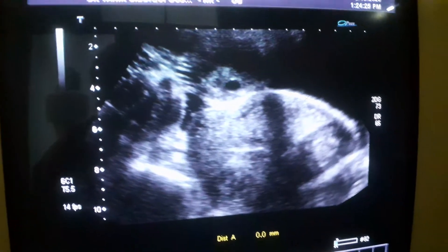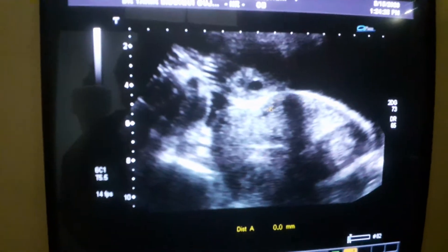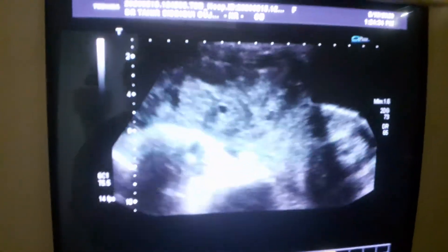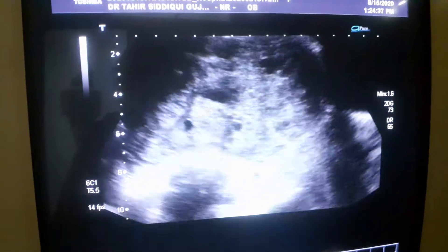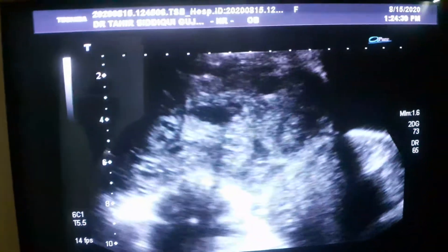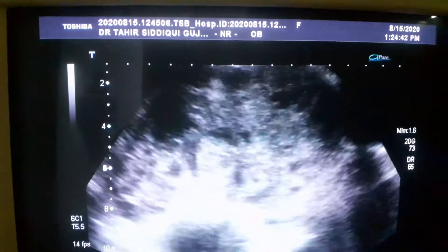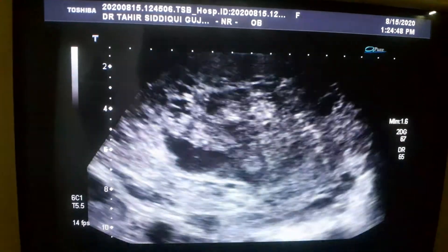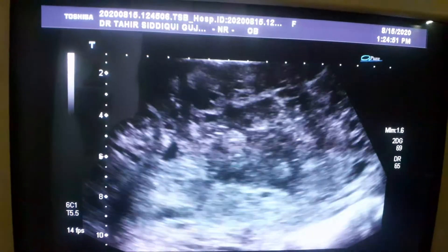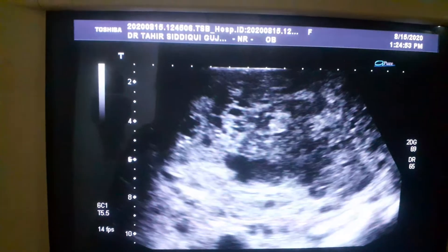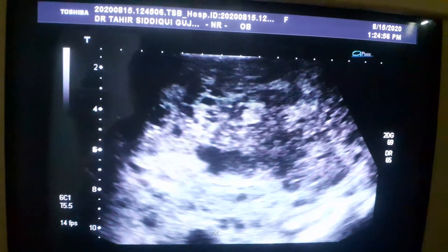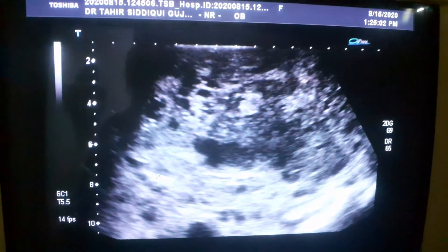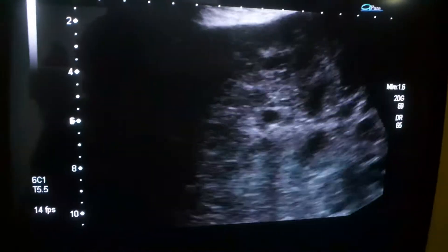This is the urinary bladder. This is the outer surface. In the longitudinal cervix view, you will see there is a complex mass extending from the region of the right adnexa, having both cystic and solid components within it. You can see cystic components along with intersecting multiple echogenic areas — so a complex cystic and solid mass.